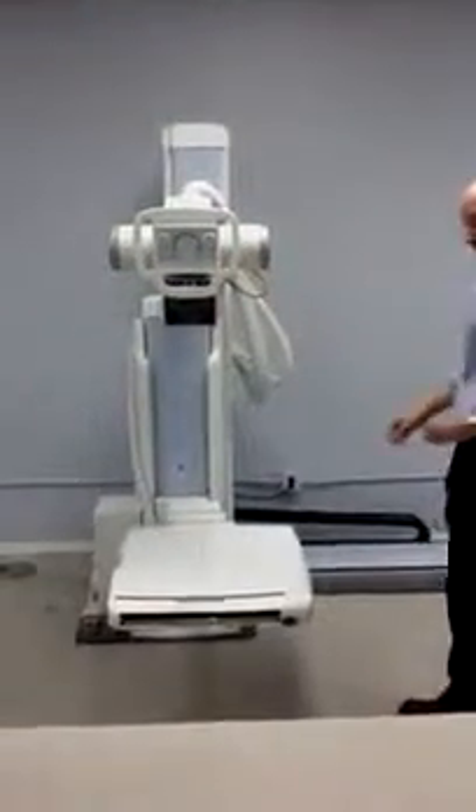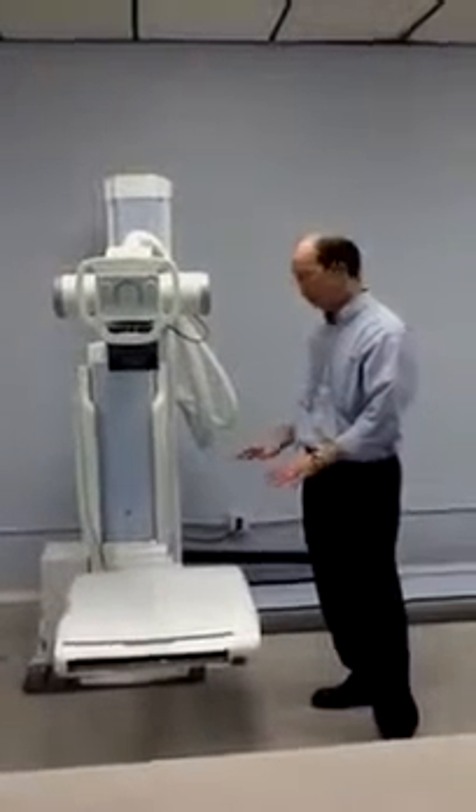So now we are set up to do table work. There is a mobile table with this system; however it is not shown here in our video.